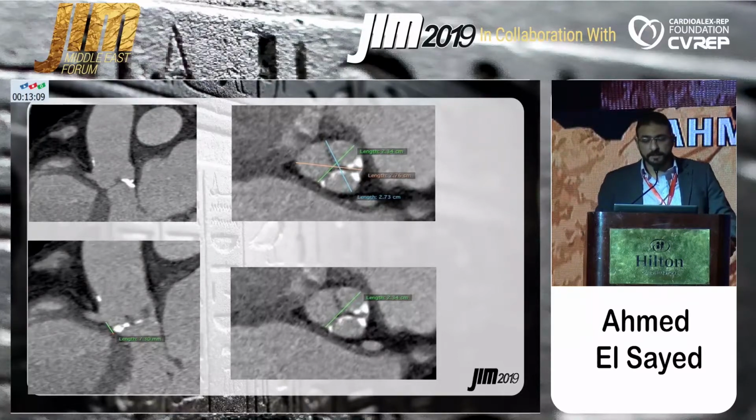23.5 millimeters. For those who are not acquainted with the TAVI procedure, what's our concern here? After implanting the new valve in the aortic position, the right coronary cusp could be displaced if the sinus of Valsalva is not spacious enough to accommodate the displaced leaflet, and there is a risk of right coronary artery occlusion.